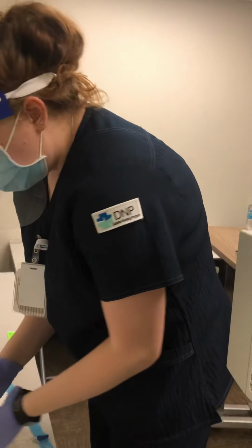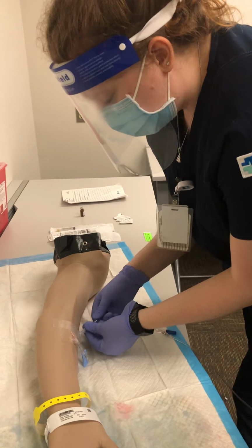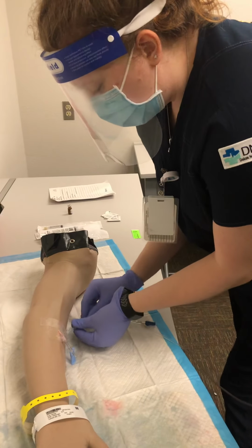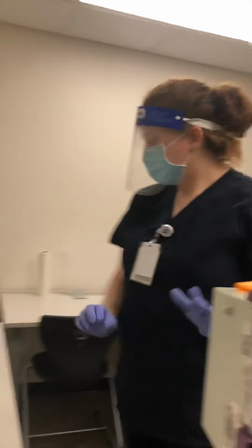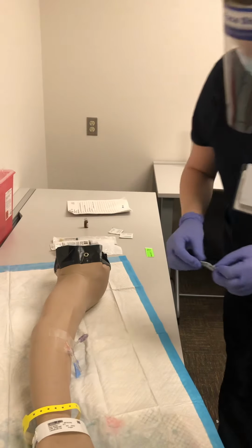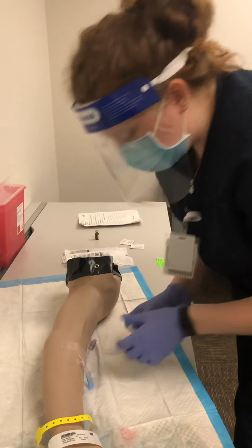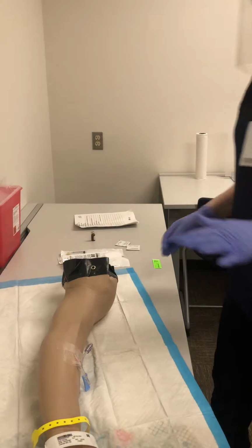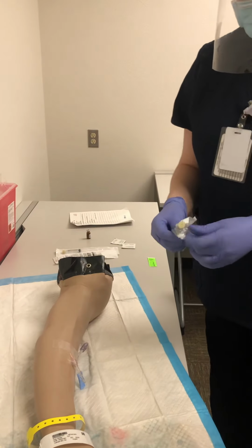All right, Shirley, so I'm just going to take a look here. All right, so we are going to take this tubing out, hang it up here for later use, and we just need to do a quick flush to get all that medication out of the line. So we're going to clean this for 30 seconds, let it dry, and then we do another 3 ml flush.